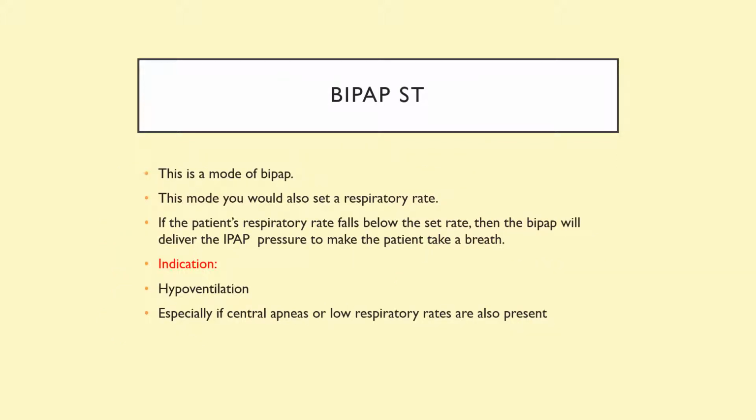BiPAP ST, this is a mode of BiPAP. In this mode, you would also set the respiratory rate. If the patient's respiratory rate falls below the set rate, then the BiPAP will deliver an IPAP pressure to make the patient take a breath to regulate their breathing.